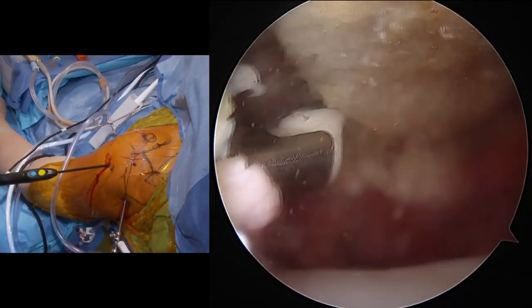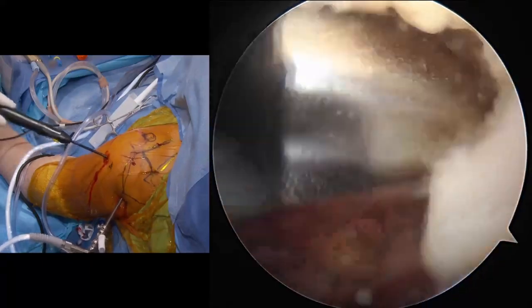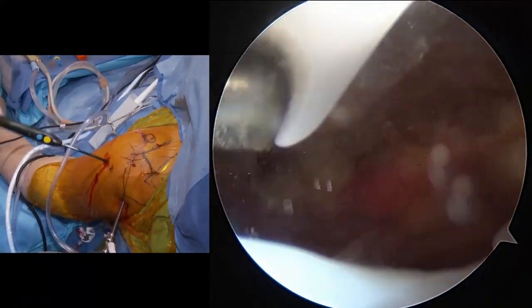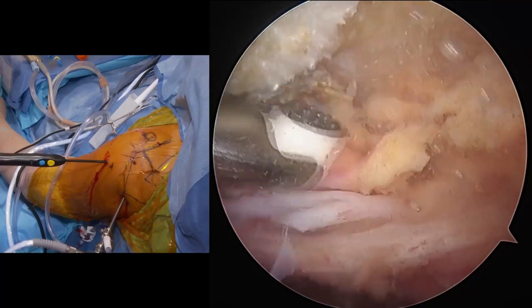We're just defining the edges of the acromion anteriorly, going into the acromial clavicular joint, and making sure we have all the soft tissues off this edge so that we can be prepared to approach and repair our rotator cuff tendon.